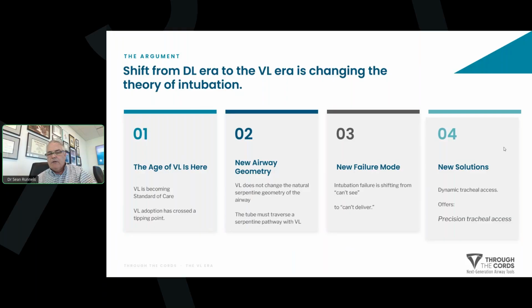So dynamic tracheal access offers precision tracheal access, and it allows us to personalize the tracheal access tool to an individual's airway geometry.